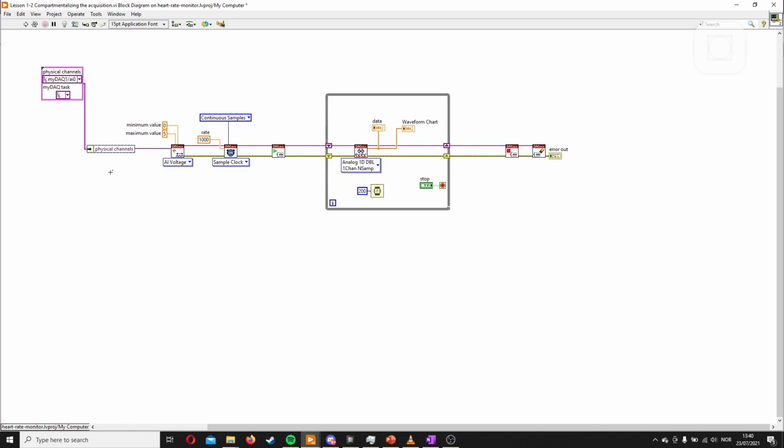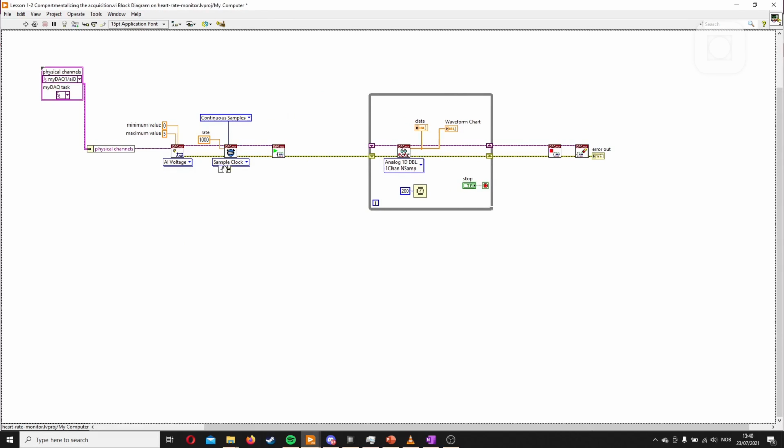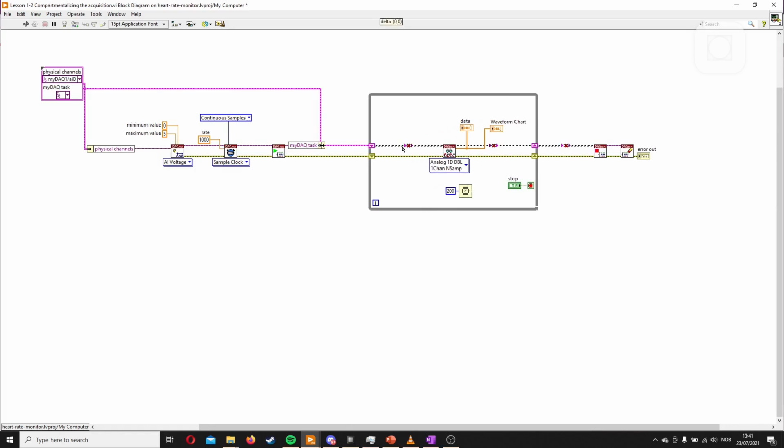And then straight lines are important in LabVIEW. Remove this one here because we want to bundle it again here. So we'll just do the same, Control space, bundle by name. Put this in here and put this in here. Now we get an error because it tries to put in the physical channel. This is a task channel. And then we'll continue here. And we'll move this one. We'll just delete each part of this one as we need to bundle and unbundle this here.